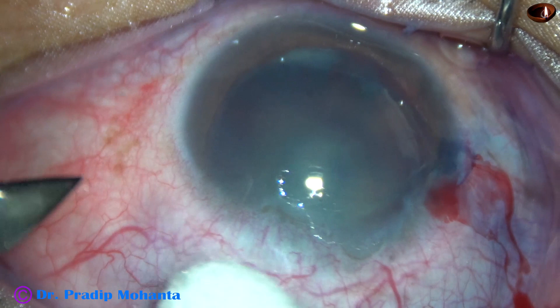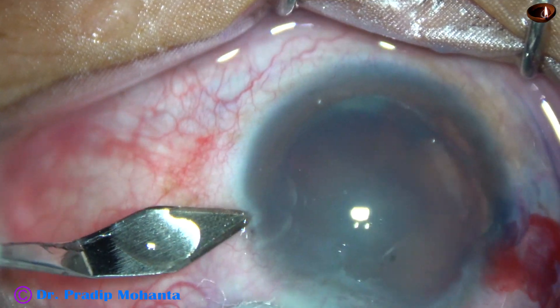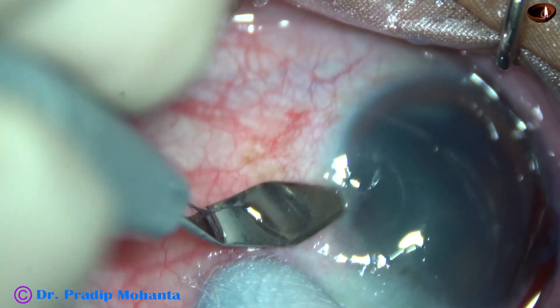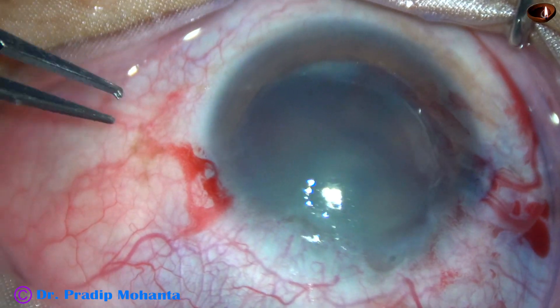Before that, this is the main incision. I am making this main incision with my left hand, and the main incision is at 2 o'clock to 2:30 o'clock.